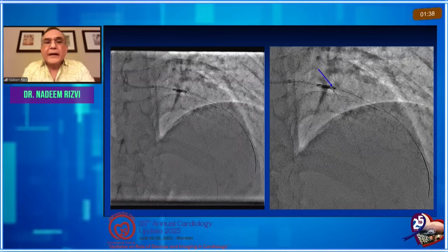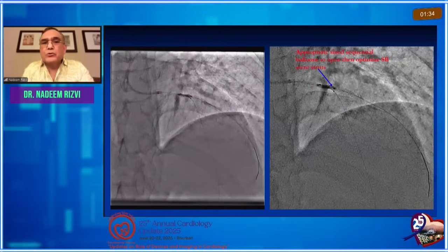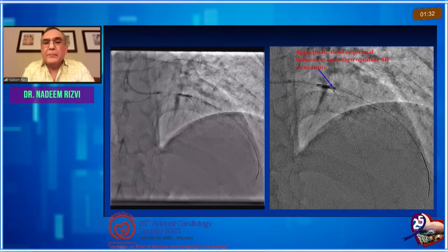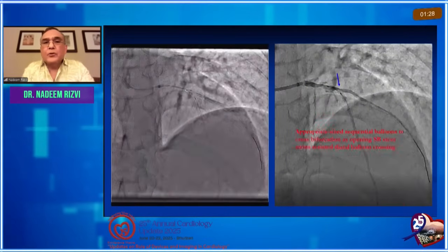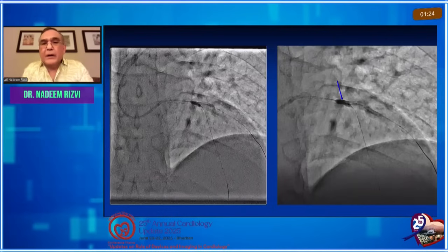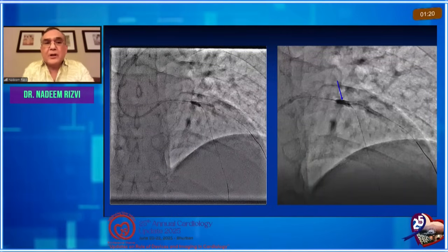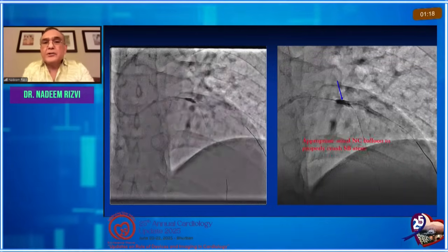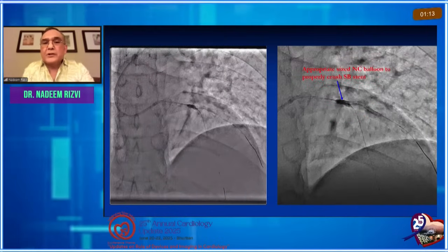All right. So then again from the inventory point of view, appropriate size sequential balloons to open up the stent. So 1 millimeter, then 2, then maybe 2.5, and then you could sequentially open it. Sometimes the main branch may not cross with the stent, so you need to open up the crush type stents, and appropriate size NC balloons to properly crush the side branch stents.